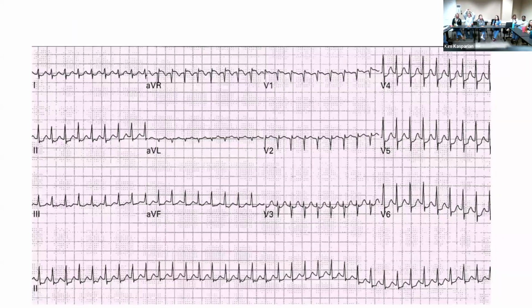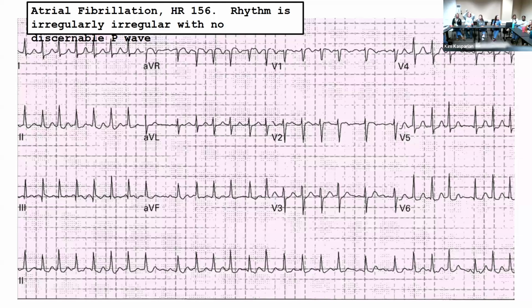All right. Well, I have a question. On the AFib. So if you occasionally have a P wave, would you still call it AFib? Yeah, I would. Because you can still have some breakthrough sinus beats. The thing is with AFib and aflutter, with both, the sinus node is still being activated. It's just that it's overshadowed by this overwhelming ectopic electrical activity.